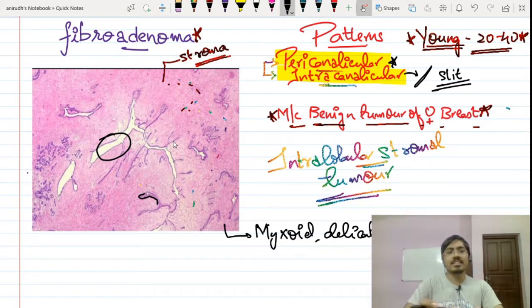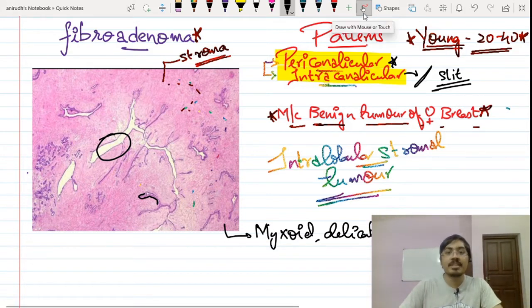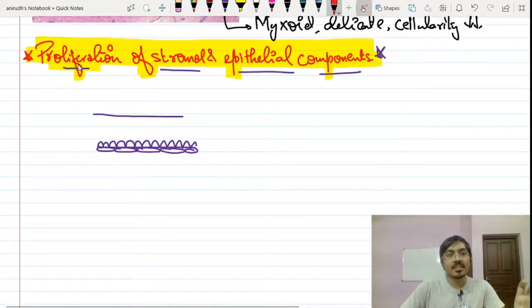in the exam. It's very easy to diagnose this. It is very easy to get that whatever they are showing is fibroadenoma just by one look at it. And then if they are giving you the history also, then there is nothing difficult in that. It's very simple and it's highly benign also. So yes. So I would like to take you towards one important sentence here.